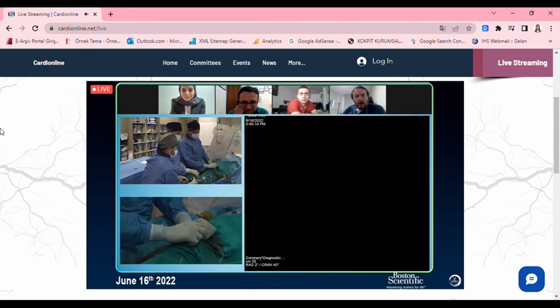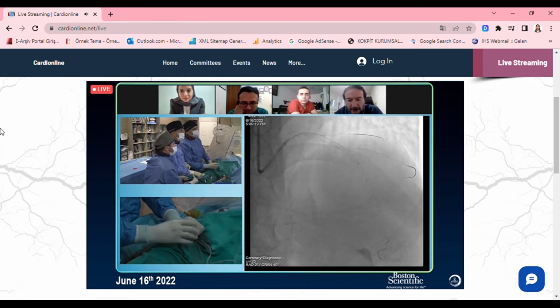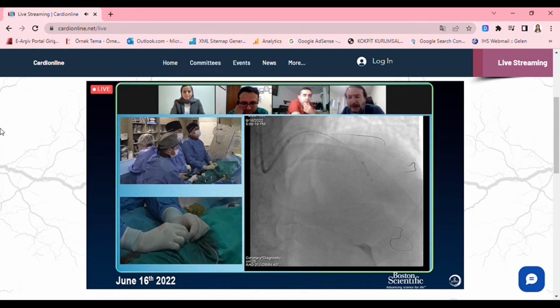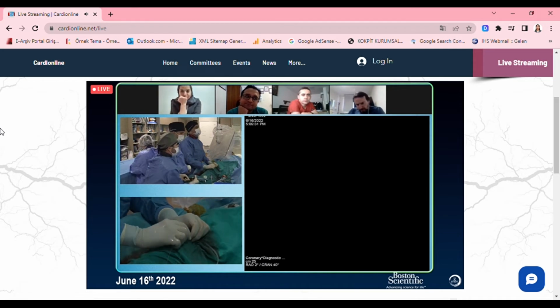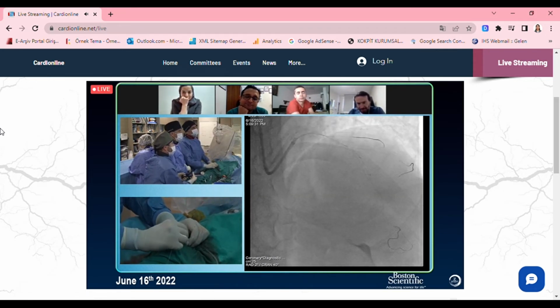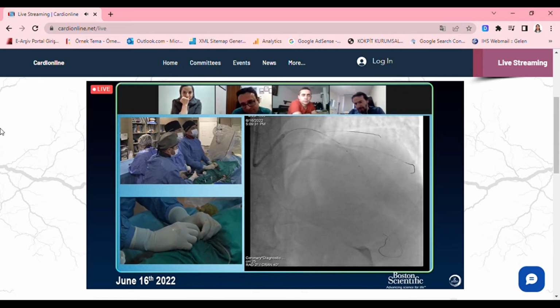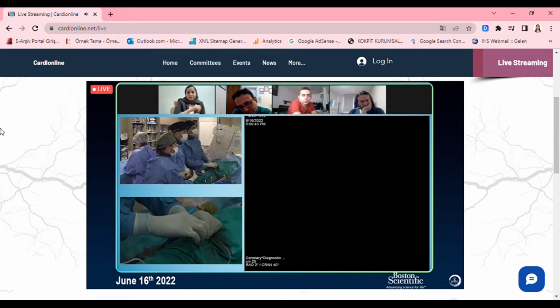Why don't you think of using some kind of scoring or cutting balloon? I'm just curious. I already used Rota, which is okay for me. If I couldn't open it, then maybe I'll try a cutting balloon. Yes, we may need it to be honest. Yeah, I agree with you. But now let's try with the NC.